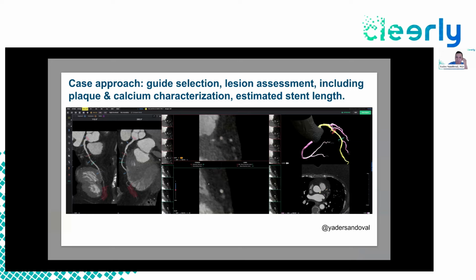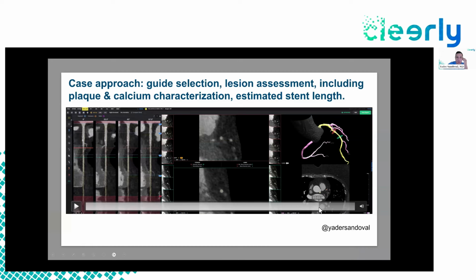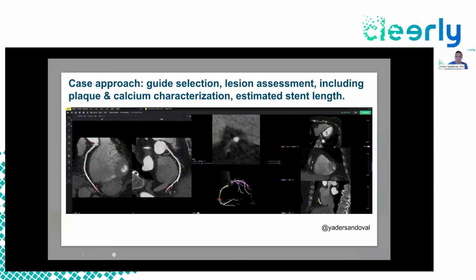Therefore, based on that, you can drop a length and get an estimate, as shown here on the multiplanar reconstruction, of how you're identifying those two healthy segments. Subsequently, you go to a distance tool, which I'm going to show right there. Once you click the distance tool, you get a sense that this is probably about a 15 millimeter stent that you want to place. So again, this summarizes how you can use CT to really guide your procedures in the cath lab. And lastly, as shown in the 3D model, you can get a sense of where that stent would be placed, in between those two diagonals, from there to there.